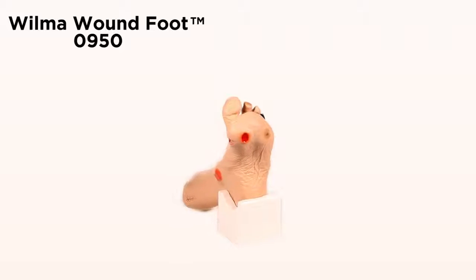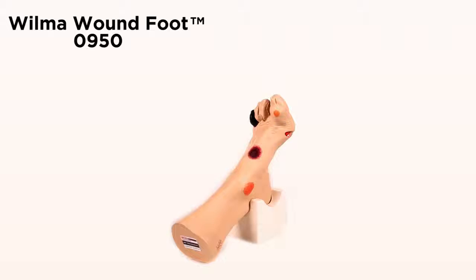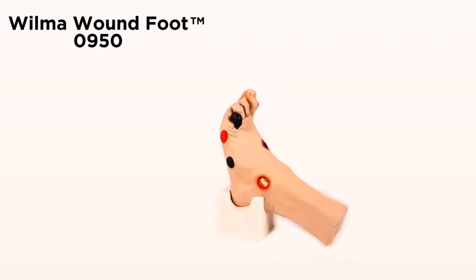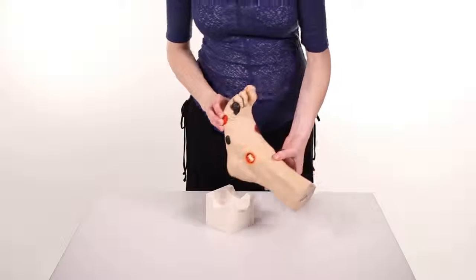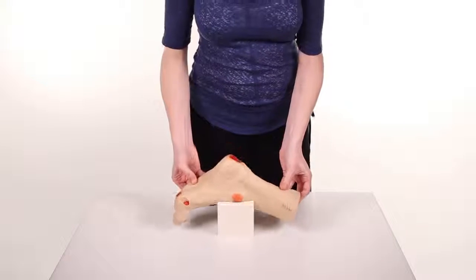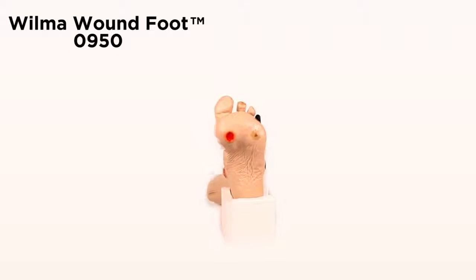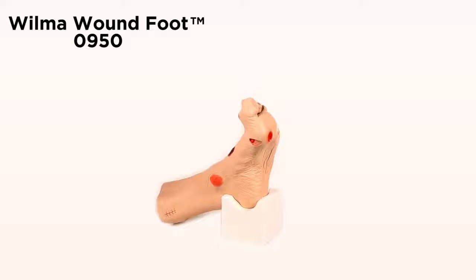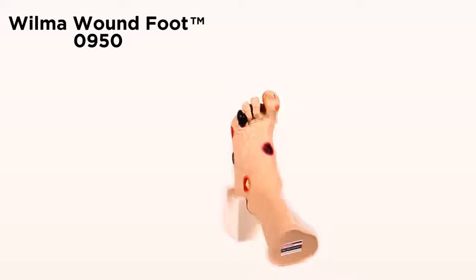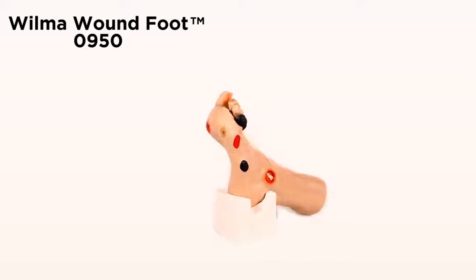This is a great model to show staff, patients and their families the various conditions present and stress the importance of proper foot care to avoid acquiring one of these conditions. This model comes with a unique stand for presentation. You can set the model in the stand to keep your hands free. Great care has been taken to color each wound just as you would see it on a patient. A great tool for identifying the various conditions, competency testing and skills assessment for health care professionals.